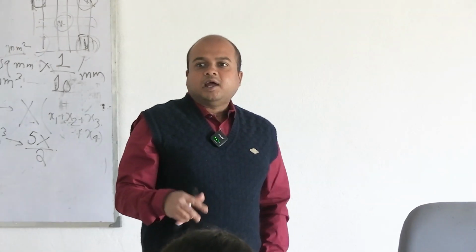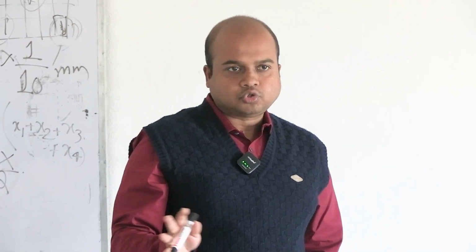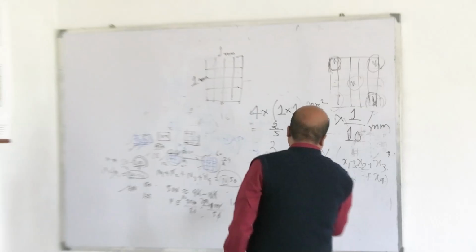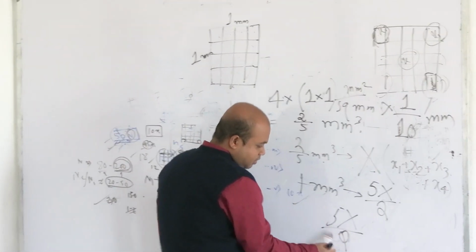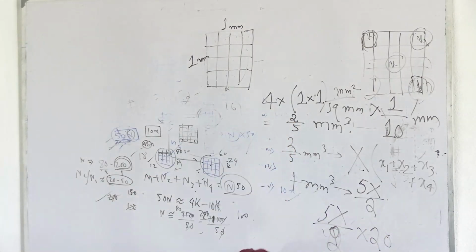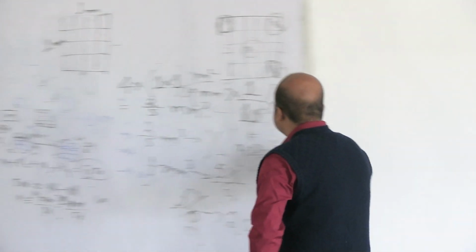As the blood has been diluted 20 times, and you should know how to dilute and why the dilution factor is 20, in case of undiluted blood it's 5X by 2 into 20, that is 50X number of cells, and you put X and get your result. That is what to do in WBC.